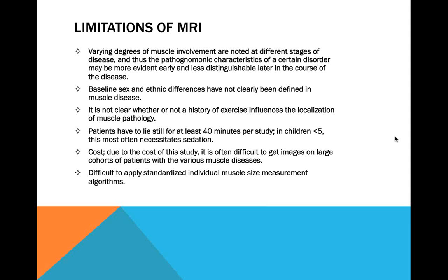But when you looked at the MRI, actually the girl who was completely asymptomatic did have muscle involvement, but just in the medial gastrocnemius muscle, the medial calf. Whereas the boy had pretty much most of his calves involved and also most of his hamstrings involved, so much more diffusely involved. So you wonder what is causing this change within the same genetic mutation.